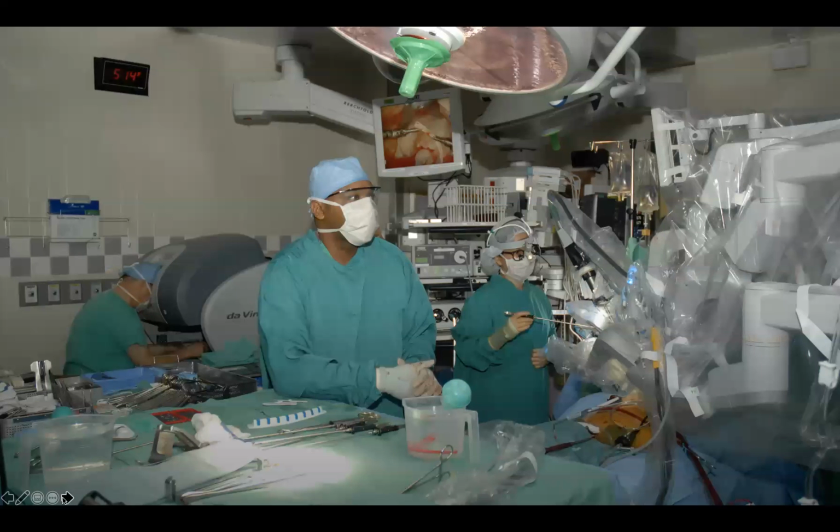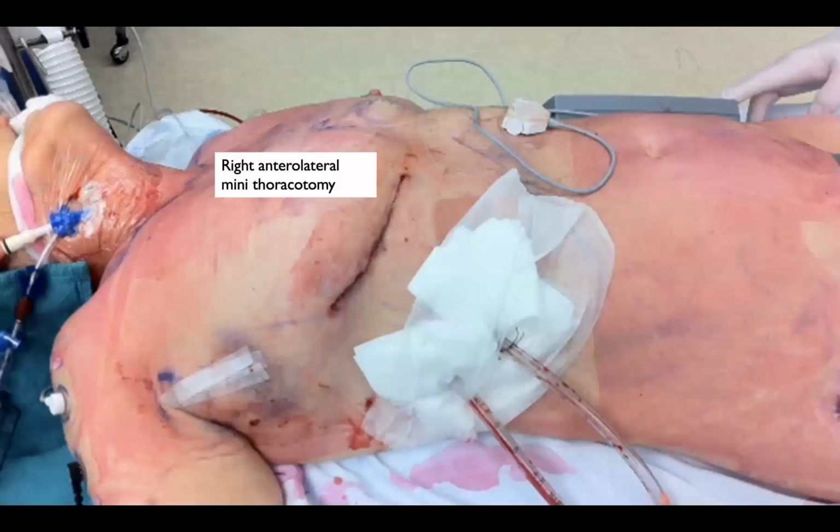Now, of course, in North Carolina, this is Dr. Chitwood. This is my fellow at the time. This is my colleague, she is now currently a cardiac staff in Newmarket in Ontario, Dr. Carolyn Tang, and this is Marvin, who just friended me on Facebook, which is exciting. And this is the robot that we were using. We don't use the robot here, but we were able to accomplish everything else without the robot using sort of a long shafted instrument strategy and obviously small incisions.